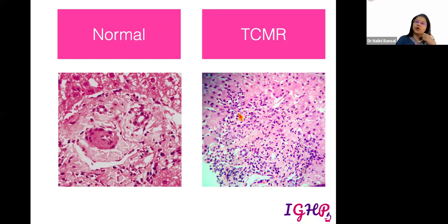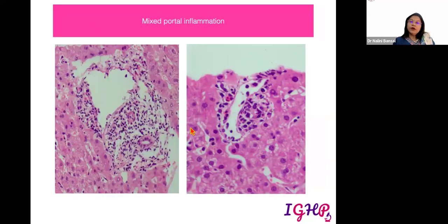First we are going to look at most of the portal areas and see what kind of infiltrate is there, and if the infiltrate is present, how much it is, whether it is mild, moderate or severe, or confined to just the portal area. Here, in this field, we are finding a mixed type of infiltrate occupying the portal area. These are two other portal tracts from the rejection area. Here also the infiltrate is mild, with a mild increase in the infiltrate. We have some lymphocytes and some occasional eosinophils. So this is the mild rejection infiltrate in both the images.